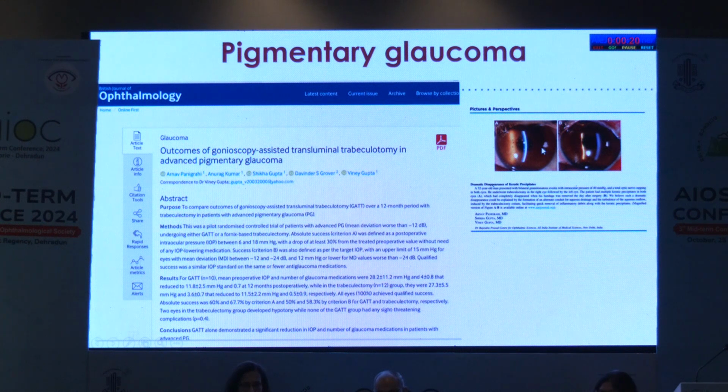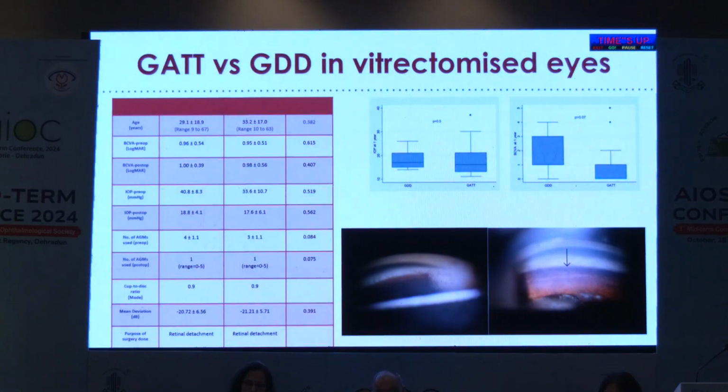This was a case report which has been recently published in Ophthalmology, where we saw that GATT surgery also helps. This is a patient with severe KPs and pigments in the AC with pigmentary glaucoma. And this is the first day post-op of the GATT surgery. Because we are de-roofing the Schlemm's canal, it also helps in the outflux of the pigments through this route and leads to miraculous disappearance of the keratic precipitates. And of course, it will also help in lowering of the IOP in the post-operative period. This series we have already compiled, that GATT can also be used.